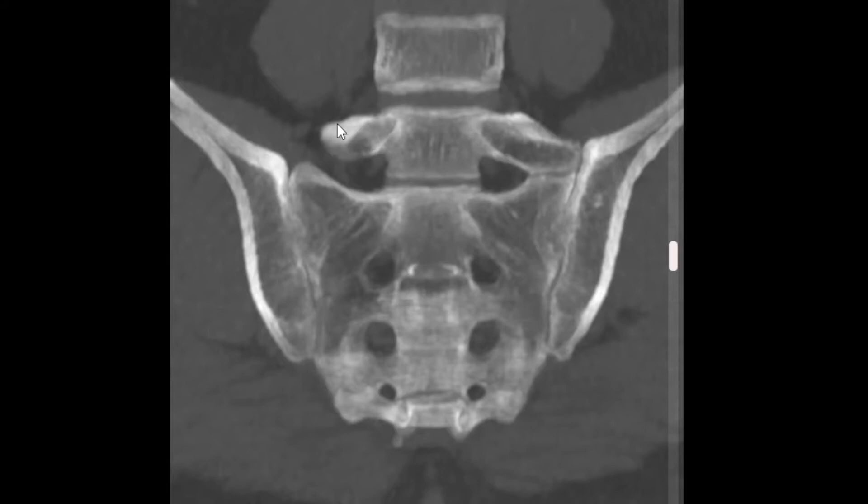Those little finger-like bones are normally small. In some cases, they're not that small — typically at the bottom lumbar vertebra. Here we have the transverse process off of our L5 vertebra. That transverse process is normal and small on one side, but on the other side it's quite a bit larger. Its growth has resulted in something called a pseudoarthrosis — this very thin line almost appears to be a joint, even though normally we don't have a joint there. That's where the 'pseudo' comes in: pseudo means fake, and arthrosis means joint. So this is a fake joint.